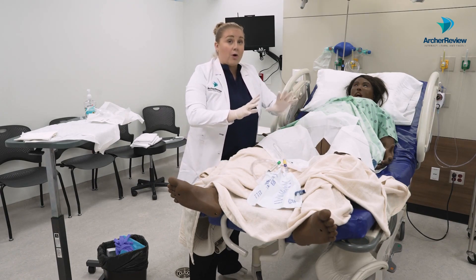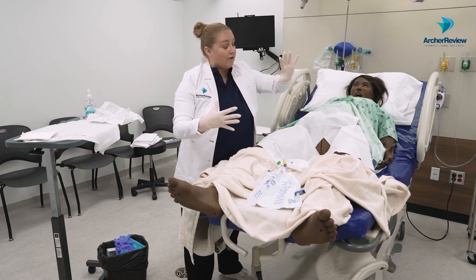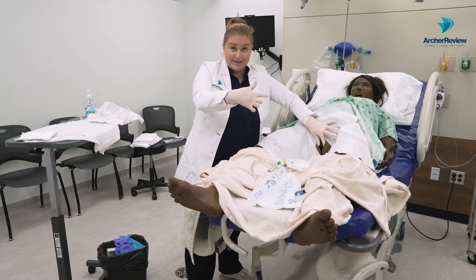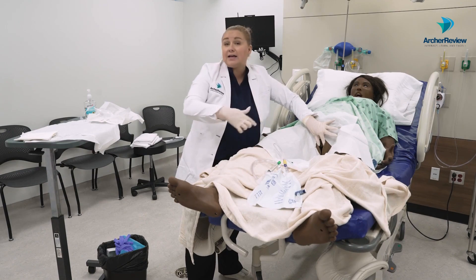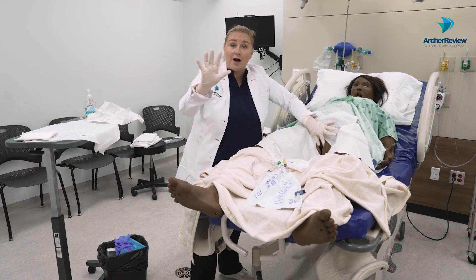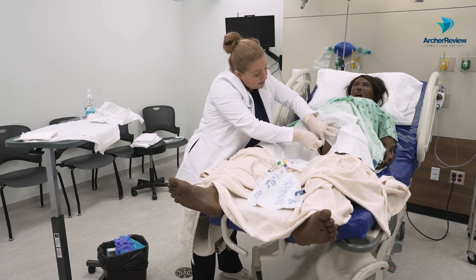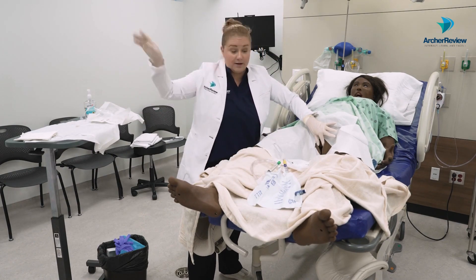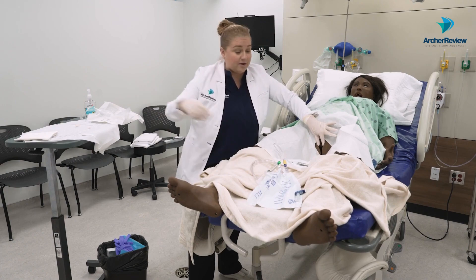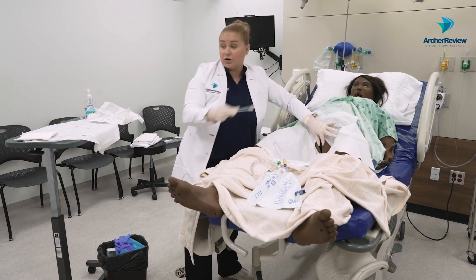What I'm about to do requires being very careful about which hand you use. I'm right-handed, so my non-dominant left hand is going to touch the client and spread their labia — so this hand is now dirty. I can't touch anything else with this dirty hand. I need to clean with my sterile dominant hand, and that's why I have my iodine swabs ready. Pick one up, swab on the left — dirty, get rid of it. Next one, top to bottom on the right — dirty, get rid of it. Last one, top to bottom right down the middle — dirty, get rid of it.